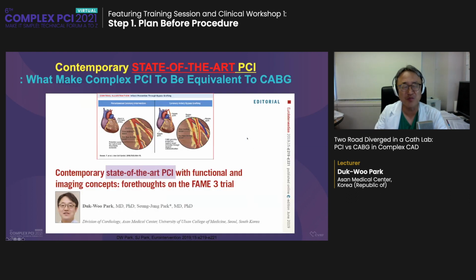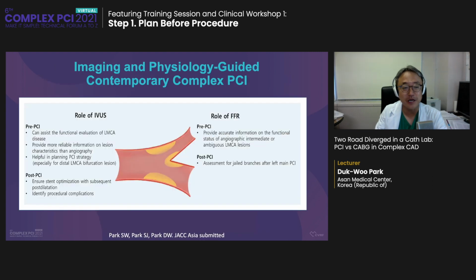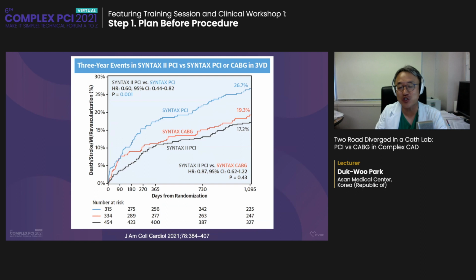Also, for our future, nowadays a lot of state-of-the-art PCI makes complex PCI equivalent to bypass surgery using functional and imaging concepts. We know IVUS well, pre-PCI and post-PCI, and FFR is very helpful for decision-making: treat, or just leave it alone. The SYNTAX trial shows that with state-of-the-art PCI versus bypass surgery, SYNTAX II PCI shows equivalent long-term clinical outcomes.